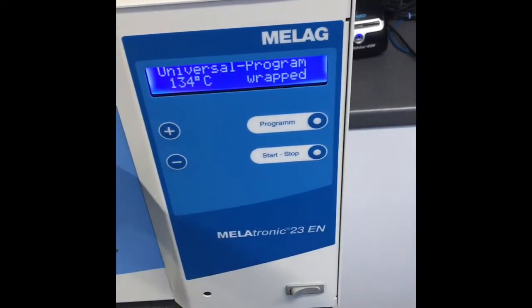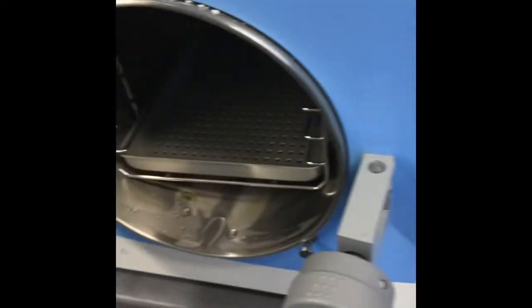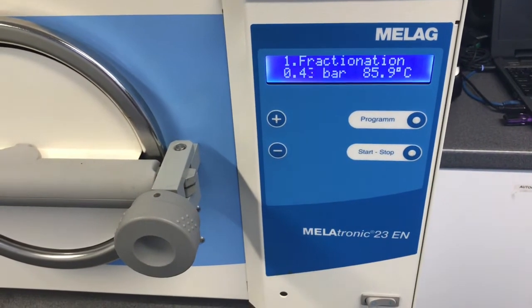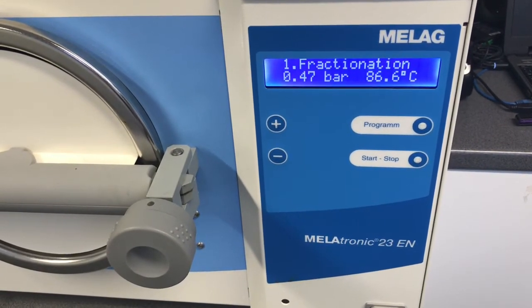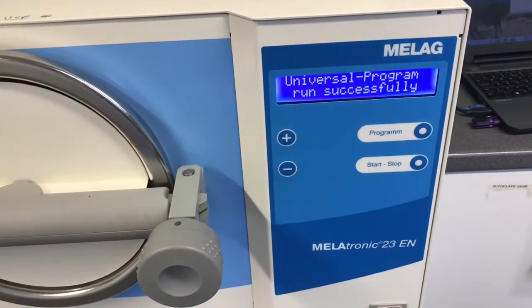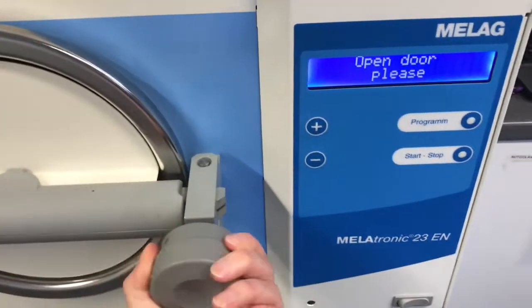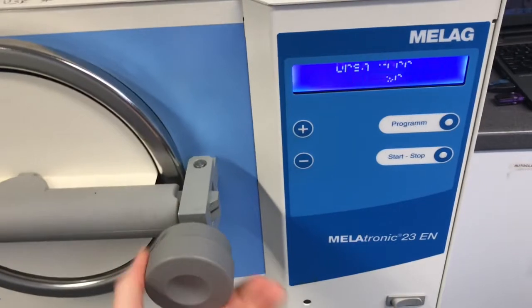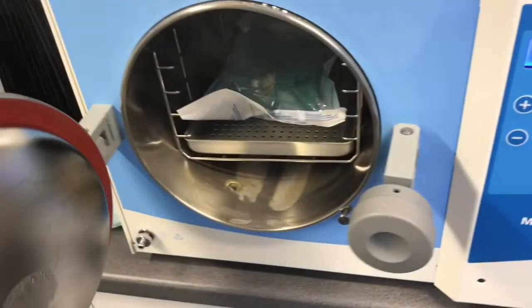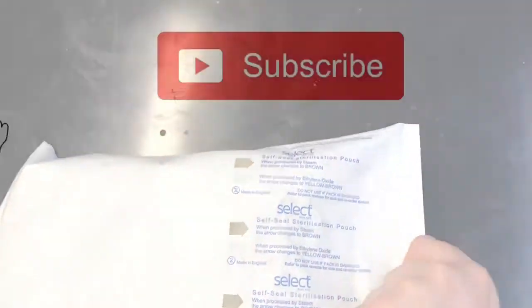I now place the finished kit in the autoclave so it can begin to be sterilised. The kit has now been autoclaved and I must carefully take it out so it can dry. As you can see, the indicator at the back has changed colour — this ensures us that it is now ready to use.